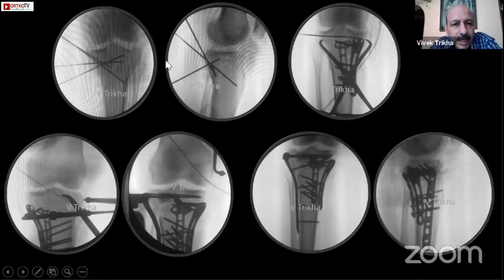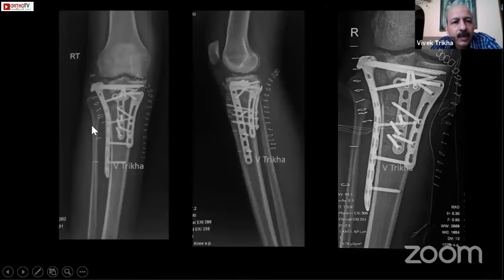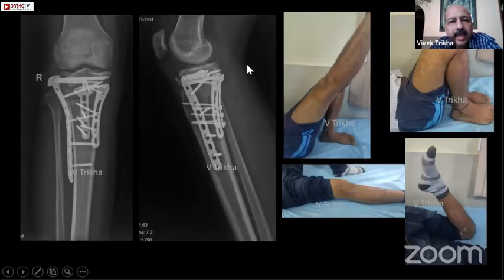So first, the medial side, the posterior side is being fixed. Then after fixing this, we are lifting up the lateral part. And once we have lifted up the lateral part, then the raft screws are going in. And this is the result which we get. So finally, there are 3 plates with an anatomical lateral view, which you can see having good articular congruity. Alignment has been maintained, which is the foremost. And this is his follow-up X-ray, which you can see that things have united with a very nice outcome functionally as well.